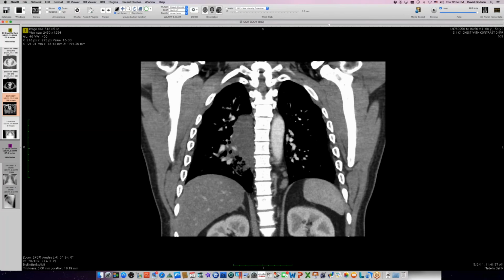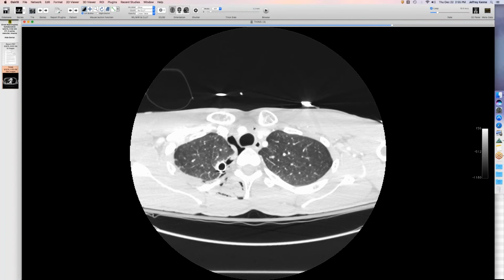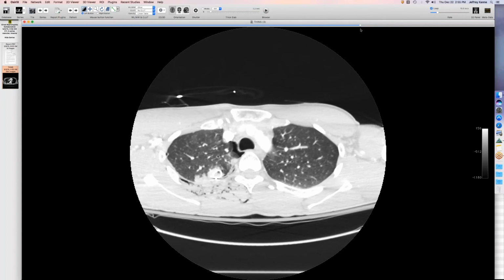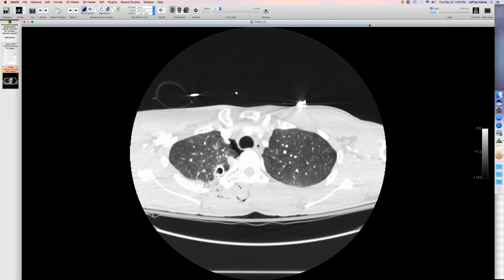Howard, if you don't mind, I've got a companion case to your azygos. Maybe one I showed before, but this was a guy who had a traumatic pneumothorax. You can see the pleural drain is in there from blunt trauma, and you'll see there's his azygos here, and there's the fissure. So it arches up like that. So this is an escaped azygos vein.